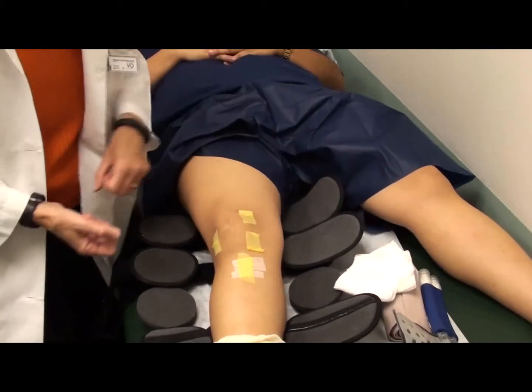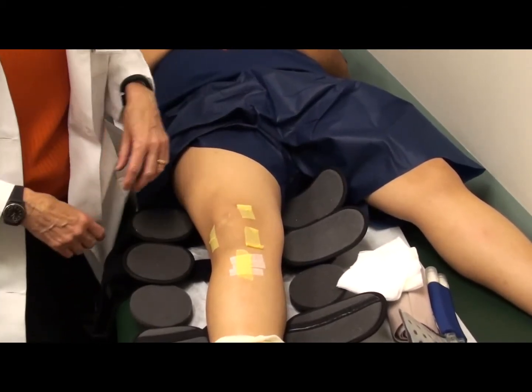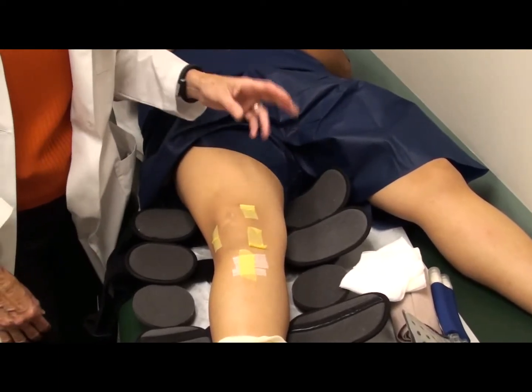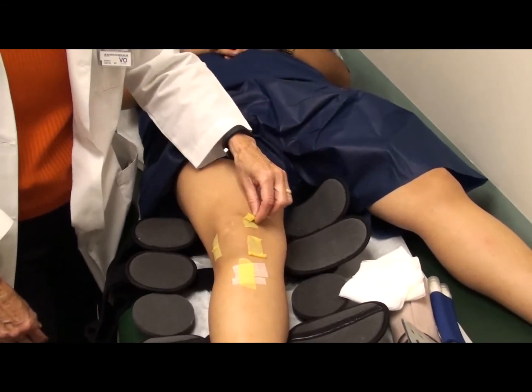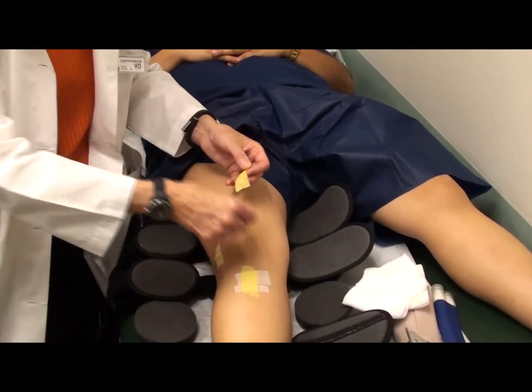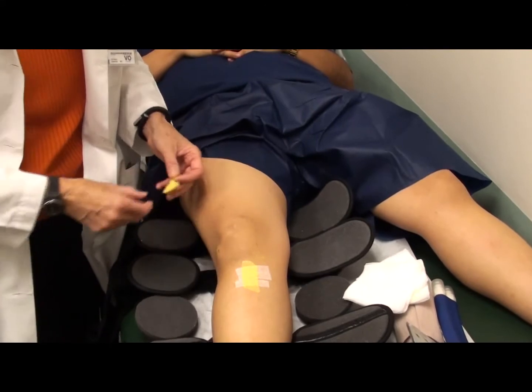Now, your knee may be kind of swollen, and I know that's kind of freaky when you see that, but it'll go down in a few days. But you'll see these little yellow tapes. These are basically just some gauze with Vaseline in it, and the reason we put these on is so that when you peel them off, it doesn't stick to the stitch. But these should come off. You can pull those off, and these 3 small incisions will each usually have 1 stitch in them.